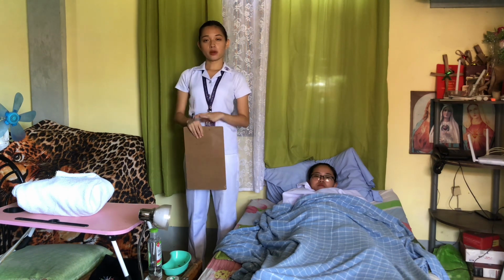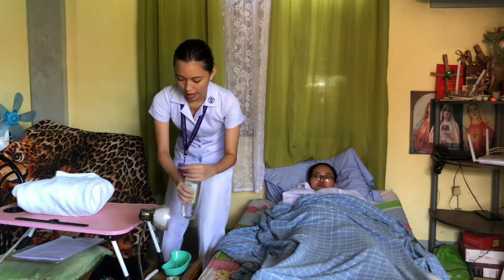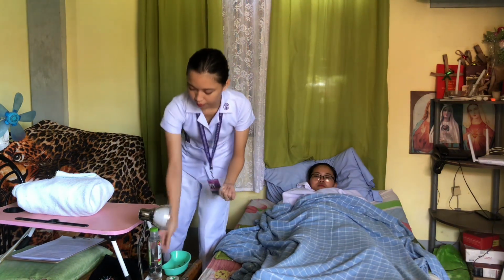Next, I have performed hand washing to deter the spread of the microorganism that causes infection and or disease and contamination. Now I'm going to perform only the hand hygiene. And I have prepared the necessary equipment to save us time and effort.